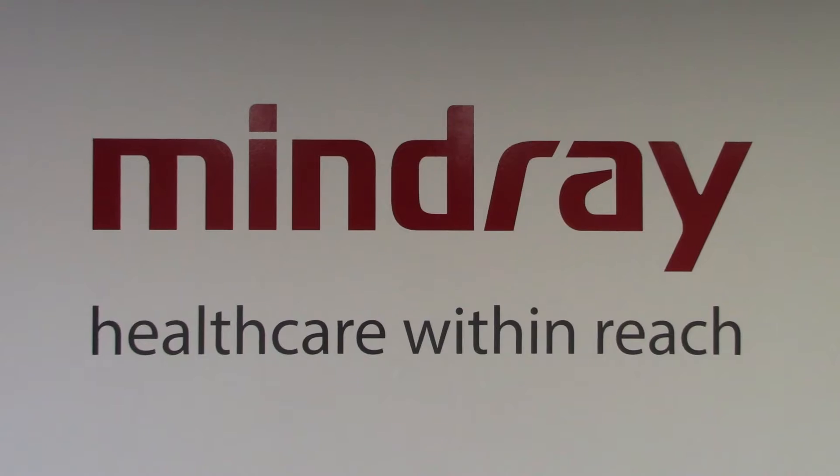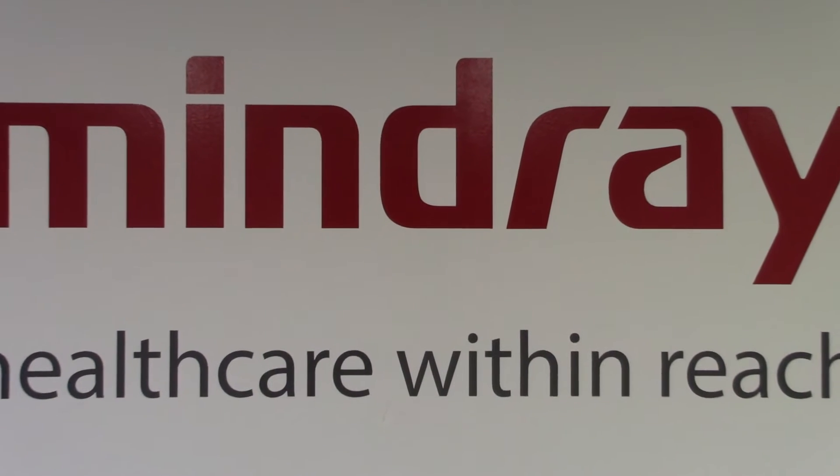Mindray. Healthcare within reach. This video covers the NIBP accuracy test on a Mindray VS9 monitor.